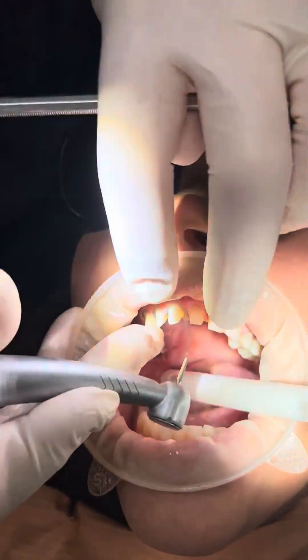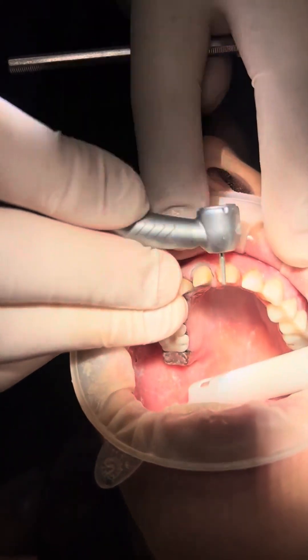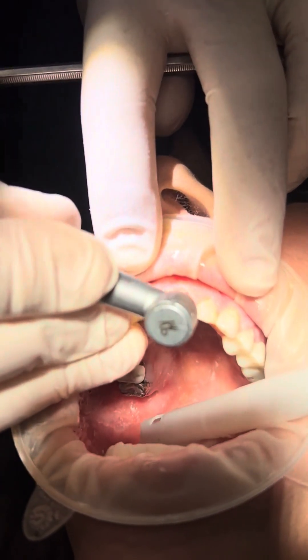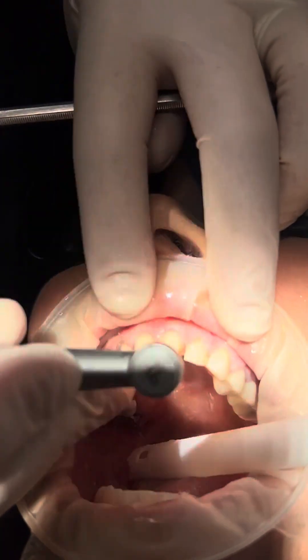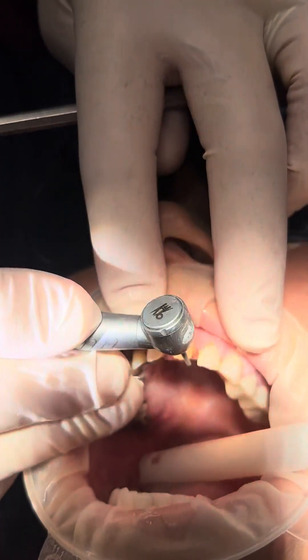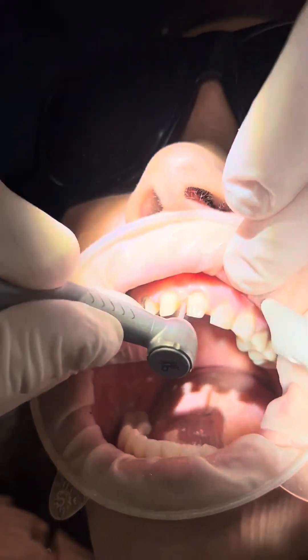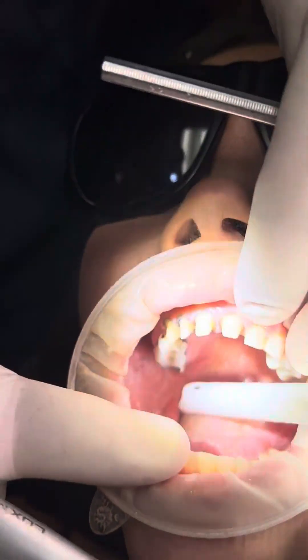Now I'm going to round up any rough spots, because whether you're using a veneer or a crown, you don't need any sharp angles. Round angle, round angle, round angle — just round everything on it. Now I'm going to verify here because I've established my 360 margin.